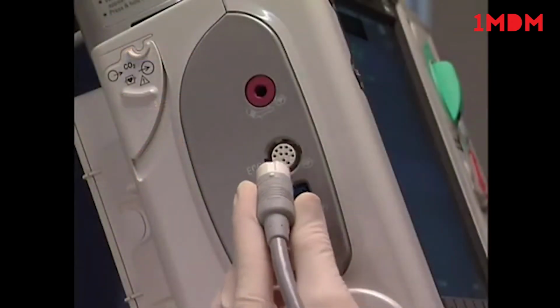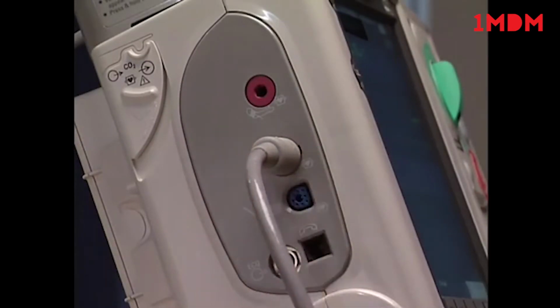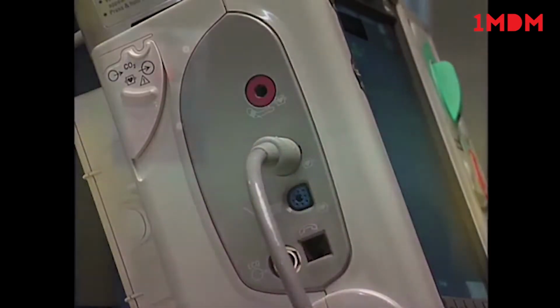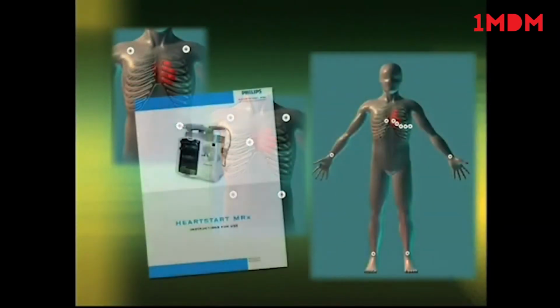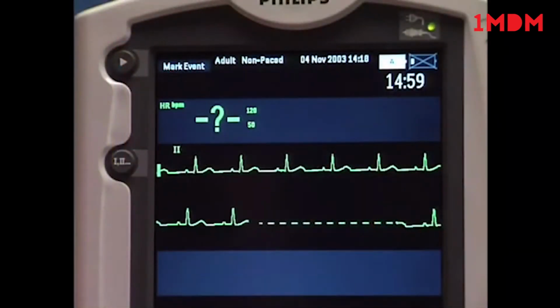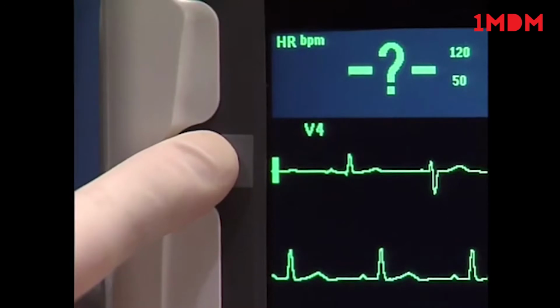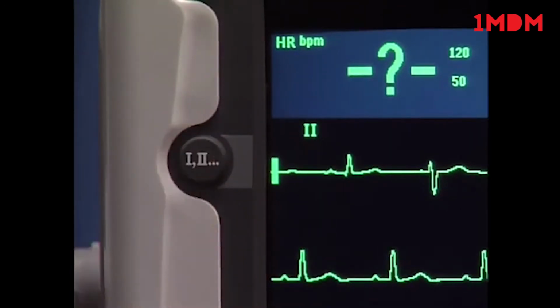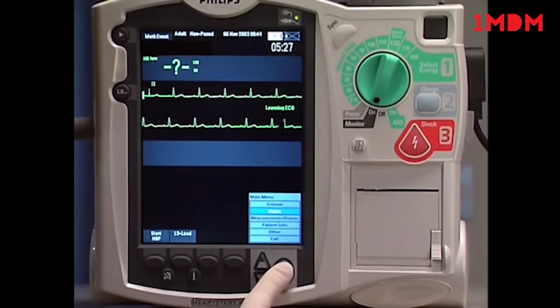The ECG cable is color-coded and keyed to fit the ECG port on the measurement connector module. For proper lead placement in 3, 5, and 10 lead sets, consult the instructions for use. The monitoring leads available depend on what type of ECG cable is connected to the MRx. Press the Lead Select button to display the desired lead in wave sector 1. To change the waveform displayed in wave sector 2, 3, or 4, press the Menu Select button.